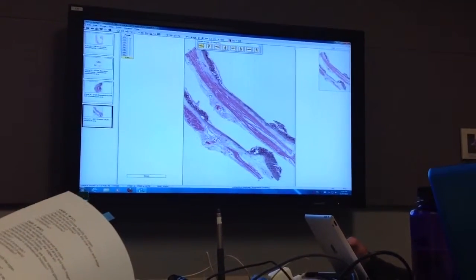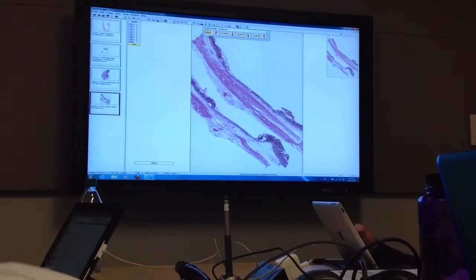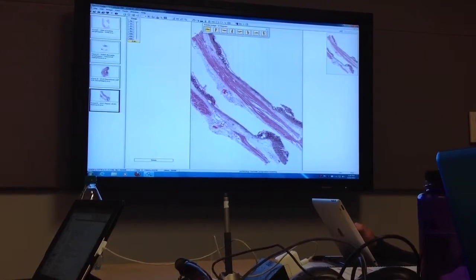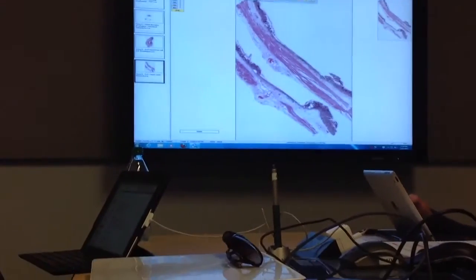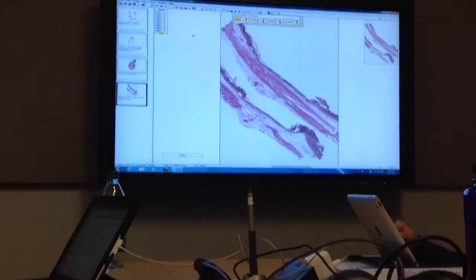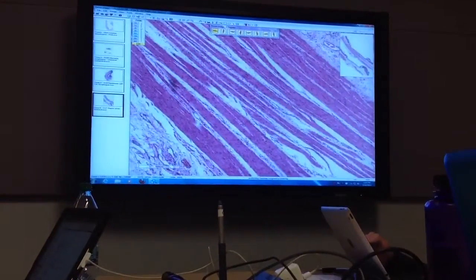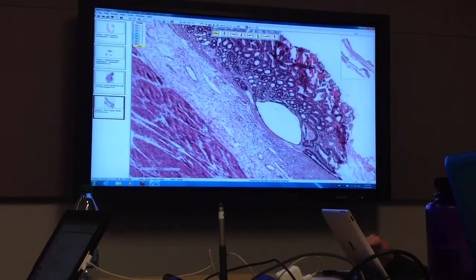And then here's the subserosal soft tissues. But what's happened here? It's gone, right? What is that? It's like an ulcer, right? At least an erosion, and found an ulcer. So let's go higher and see if we can figure out what it is. Oops, too high.